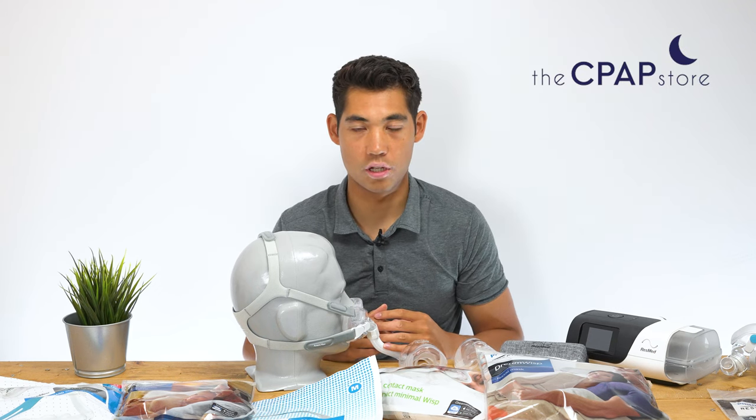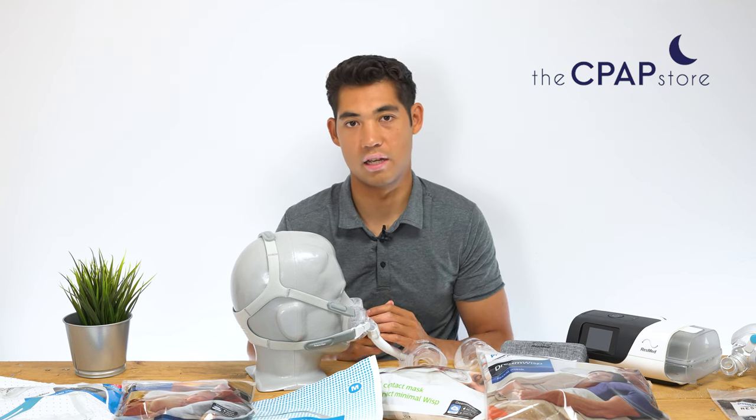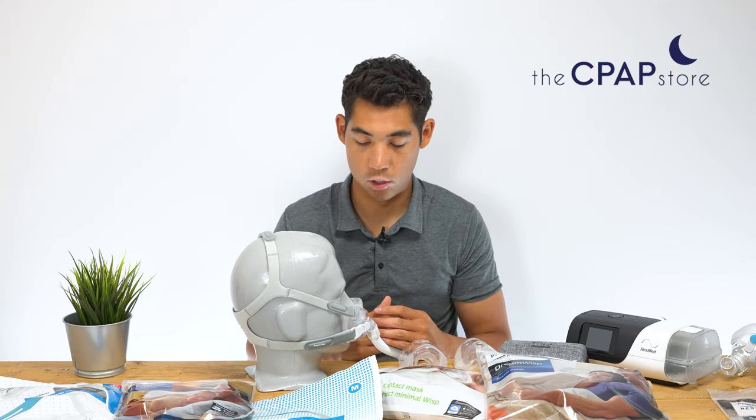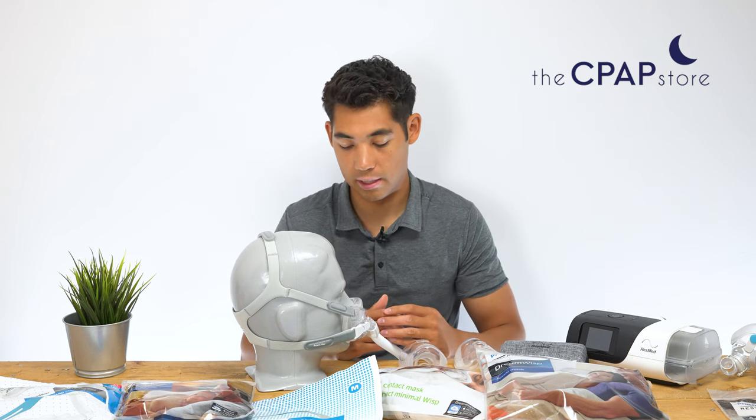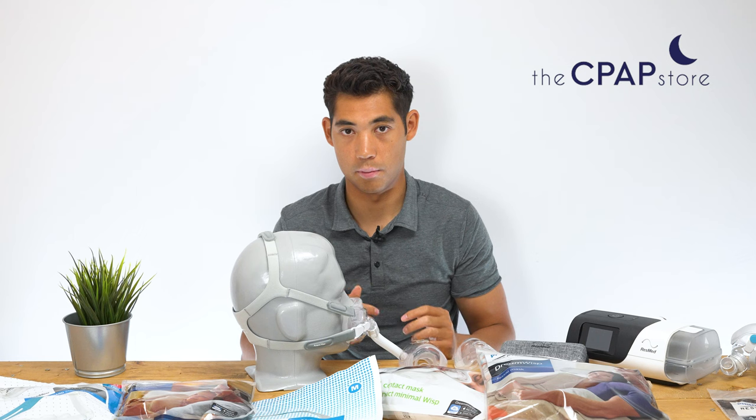Hi, my name is Tristan from cpapstore.ca. Today we're going to be looking at the Amara View Full Face Mask by Philips Respironics. It's a hybrid full face mask — a less intrusive full face mask — because it's a cradle full face versus going over the top bridge of the nose.